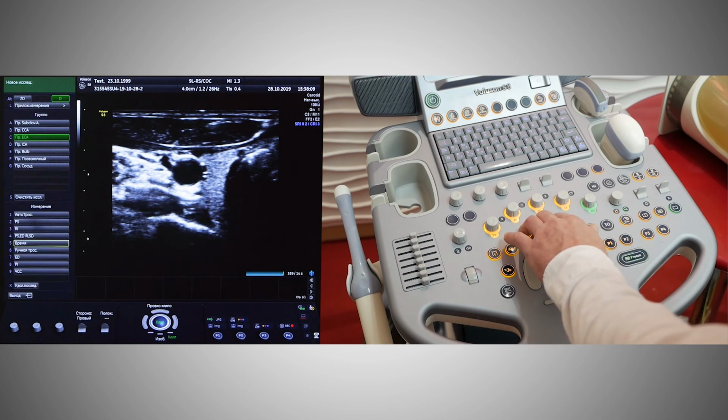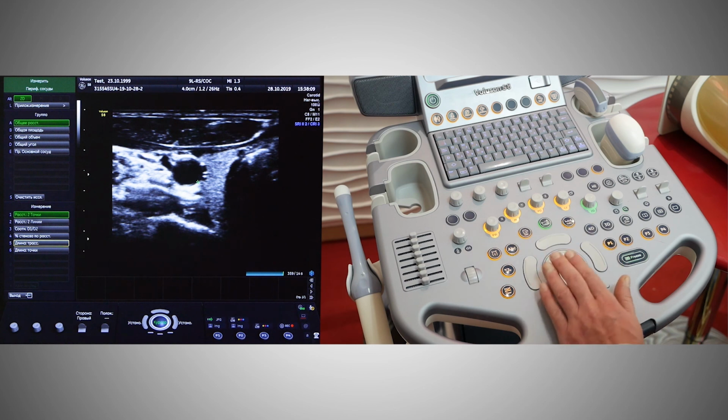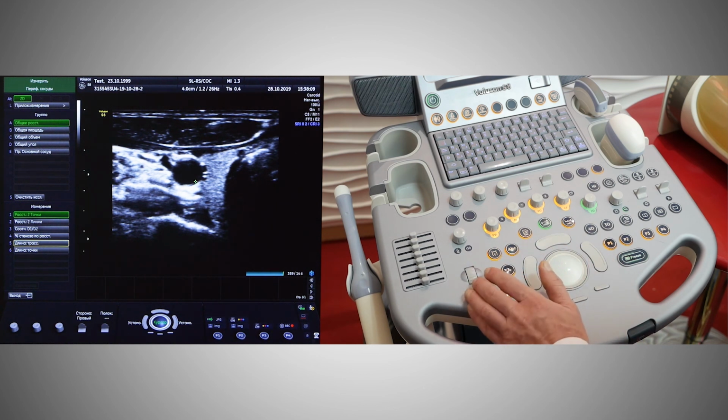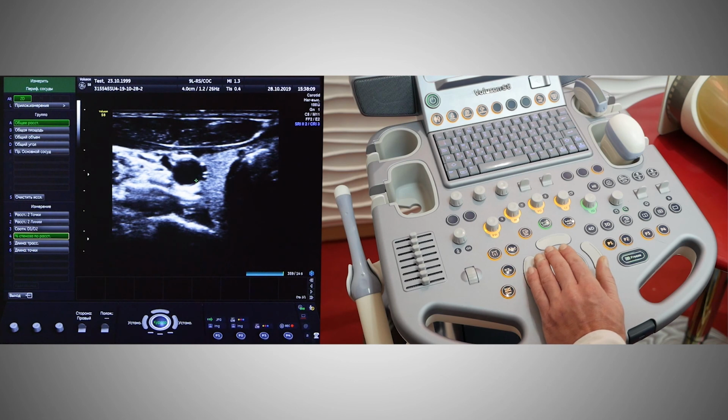Vascular examination, which this machine performs on the vessels. What are we interested in? First of all, it is artery stenosis. Arterial stenosis is determined by distance. We set the second distance. Let's see the result.